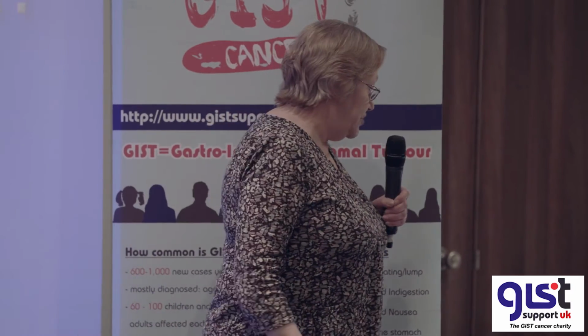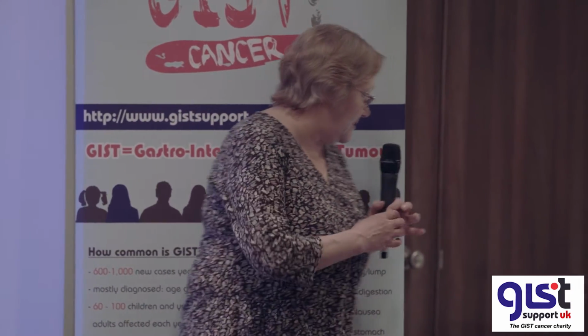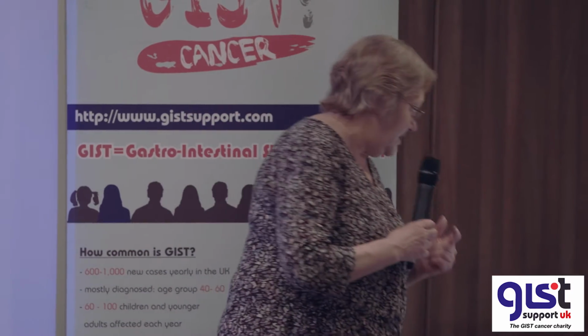The one we use mainly now is called RECIST, which is Response Evaluation in Solid Tumours. And that's on version 1.1. They just tweak the criteria every now and then. And that's the one we use for most cancers. Most clinical trials will use the RECIST criteria. There's a different one for lymphomas because they go to lymph glands and they behave differently.